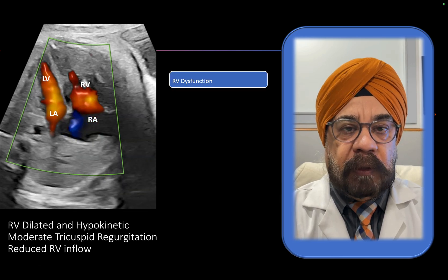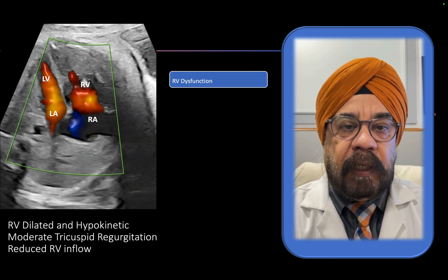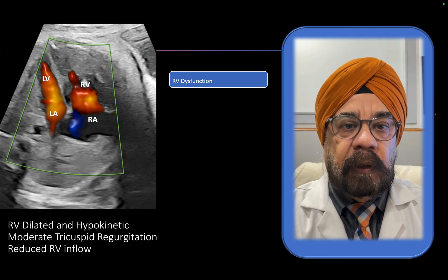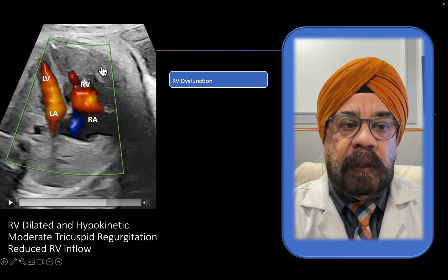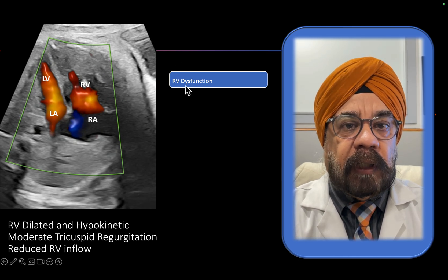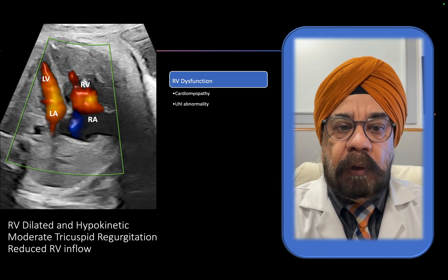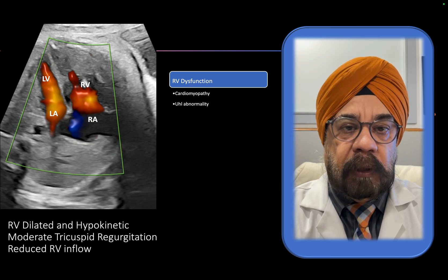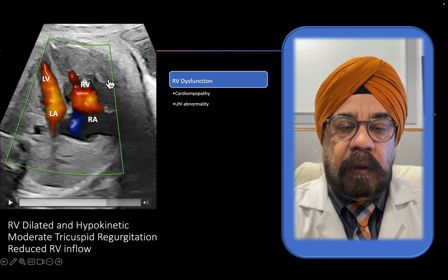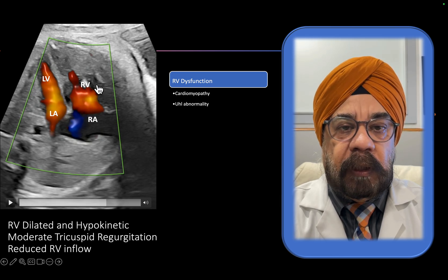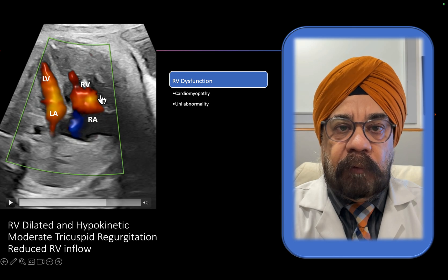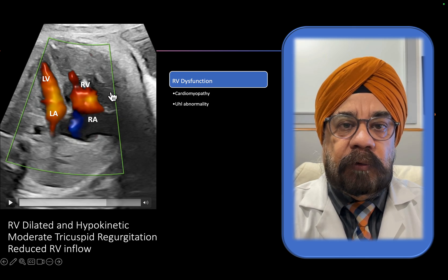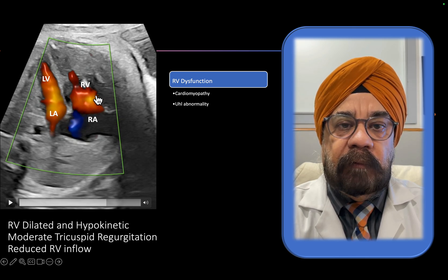What do we infer from this? There are three situations which can cause this. The first thing that comes to mind, because the RV is hypocontractile, is RV dysfunction — a myocardial abnormality like cardiomyopathy, which can rarely involve only the right ventricle. However, the issue is that inflow signals and inflow blood volume would generally remain almost the same in cardiomyopathy.